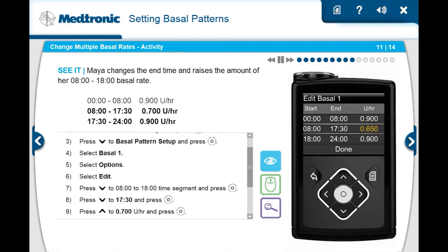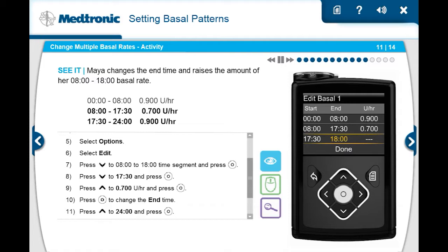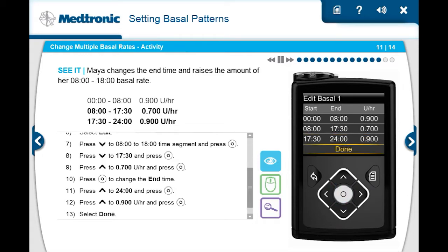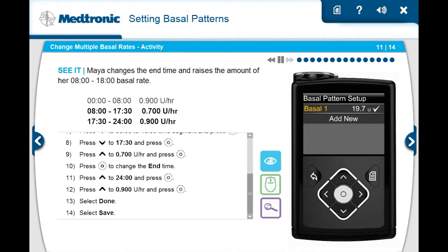She sees the start time of the third time segment changed to 5:30 p.m. and needs the end time rate to be set. She presses select to change the end time. Maya presses up to 12 a.m. and presses select. She presses up to set the rate to 0.900 units per hour and presses select. Maya selects done. She verifies the basal rates are correct and selects save. Maya has finished changing her basal rates.